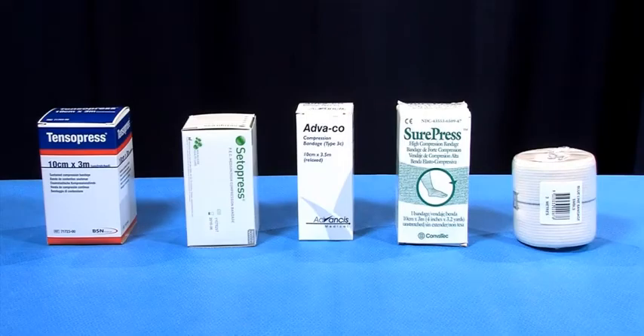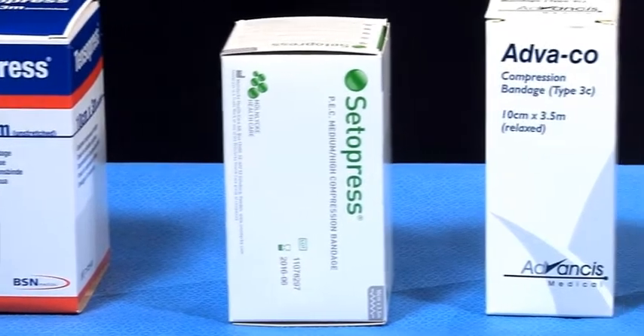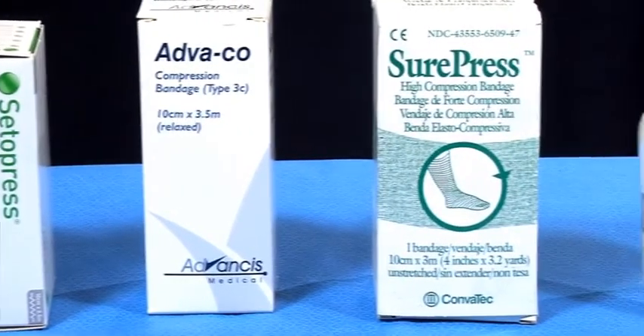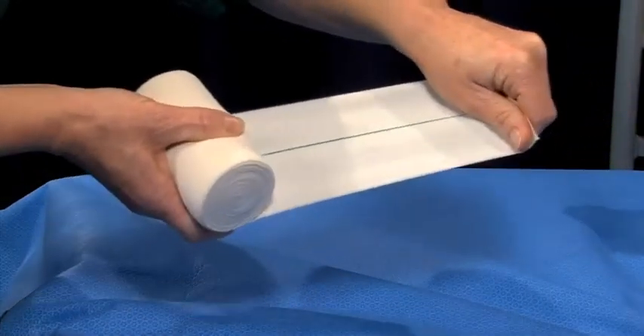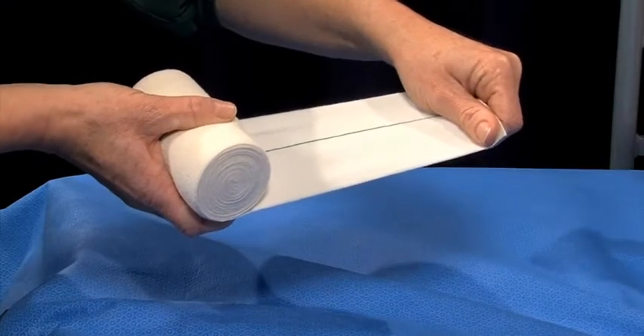There are many different kinds of elastic bandages available on the market, and these are a few that you may come across in your practice. Elastic bandages, also known as high-stretch bandages, are highly elasticised and provide constant pressure.